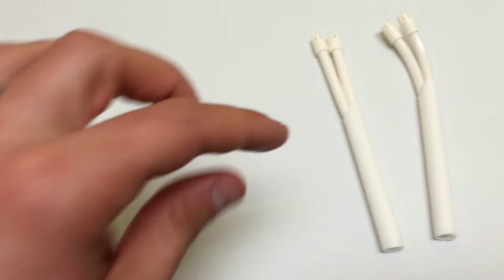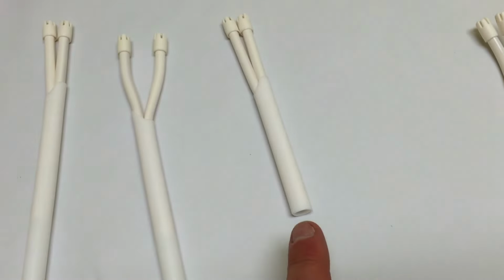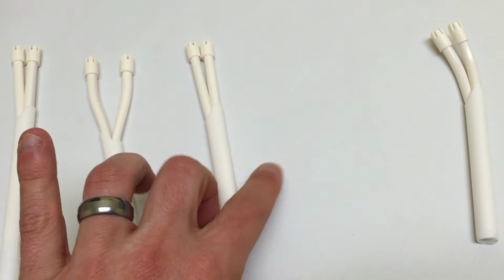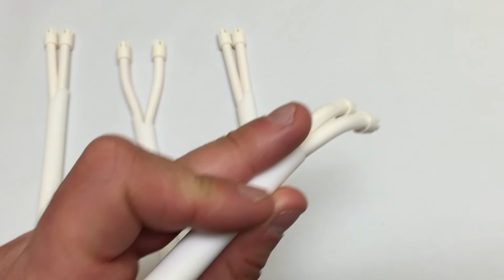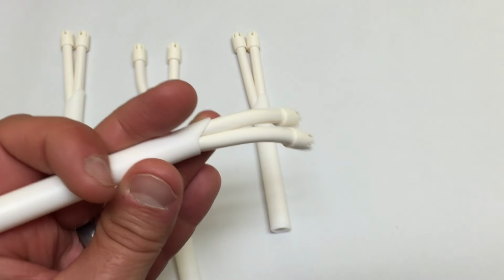I also like to cut the HVE tip down a little bit to keep it shorter. It's a lot easier to handle in the HVE valve and whatnot. And when I'm using it for the retraction function, I like to curve it a little bit. It gives better room and is a lot easier to deal with too.